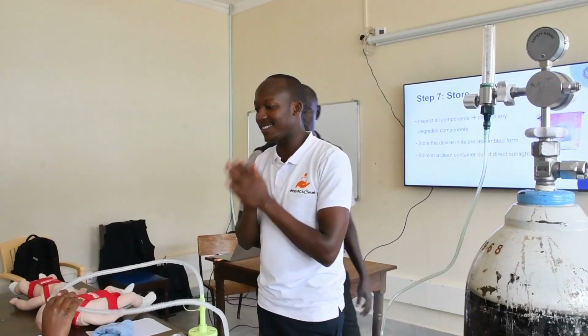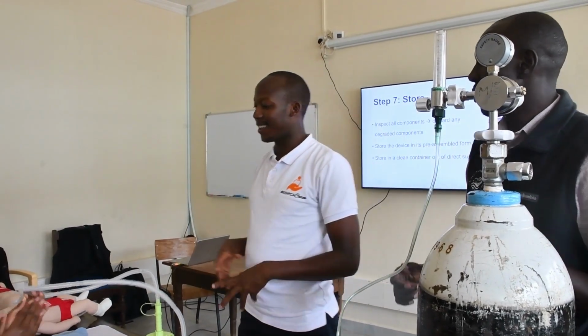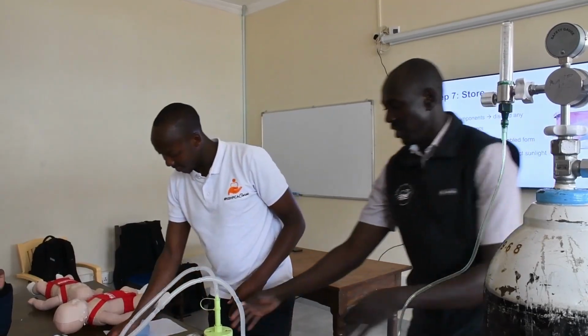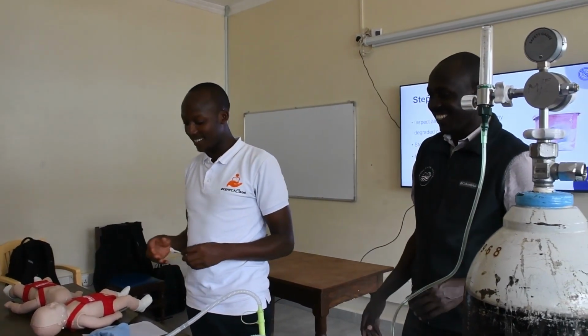Our system is ready. The next thing is the patient. You have just tested that your device is working.